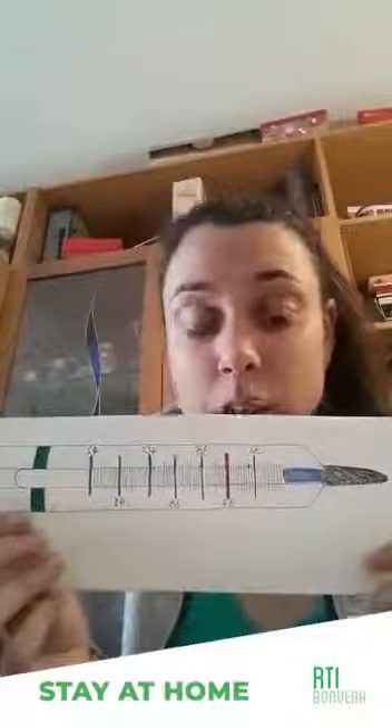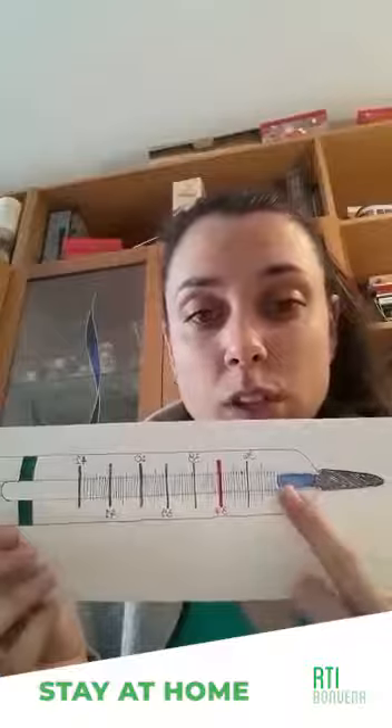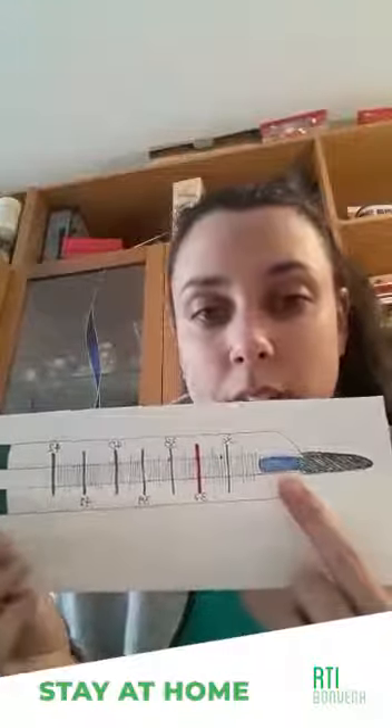First of all, before starting you have to check if the blue line is at the beginning. If the blue line is not there and it's in another part of the scale, you have to put it down. How? You take the thermometer and you shake it down like that.